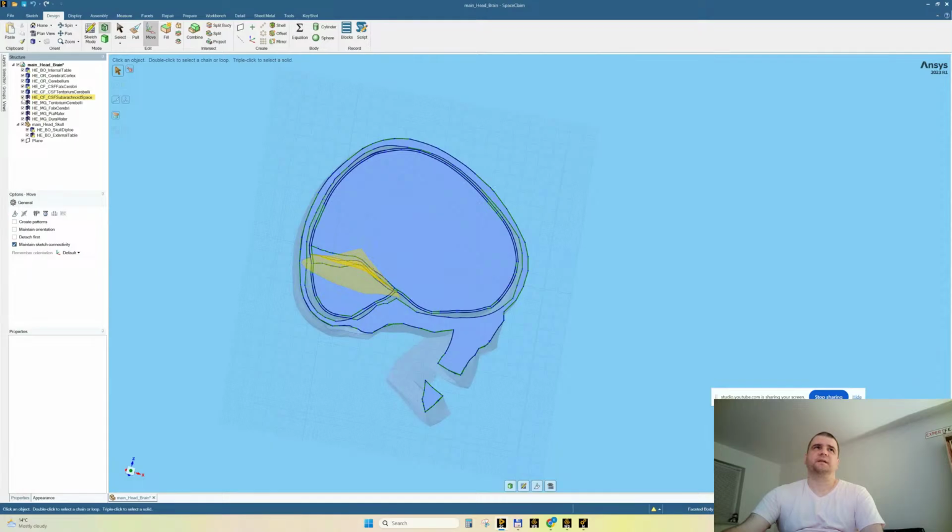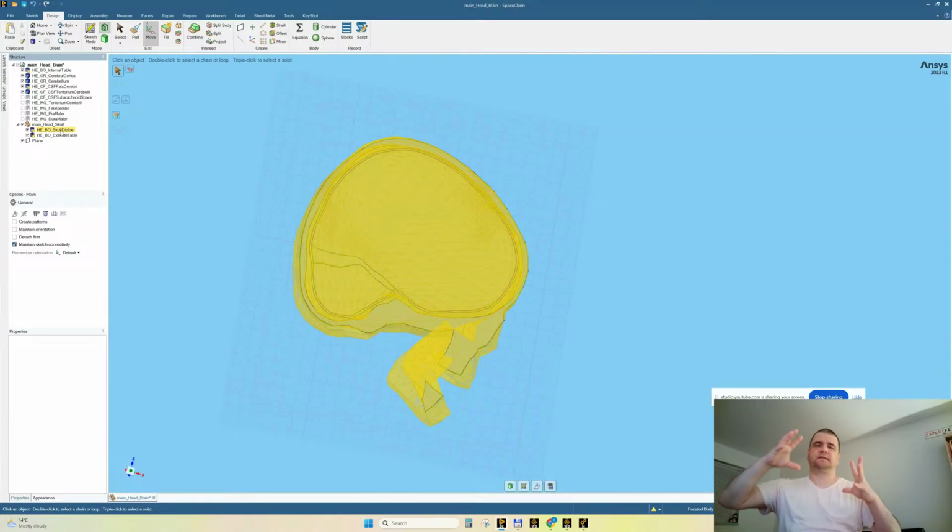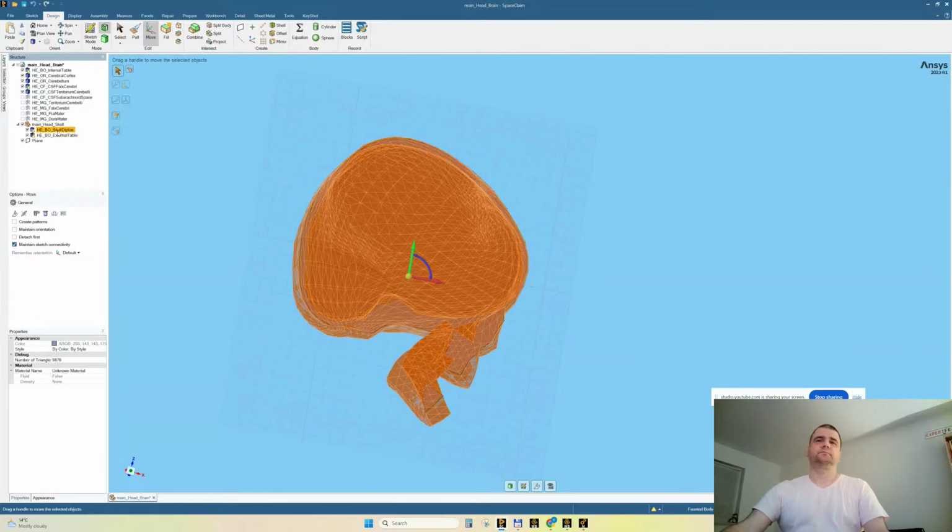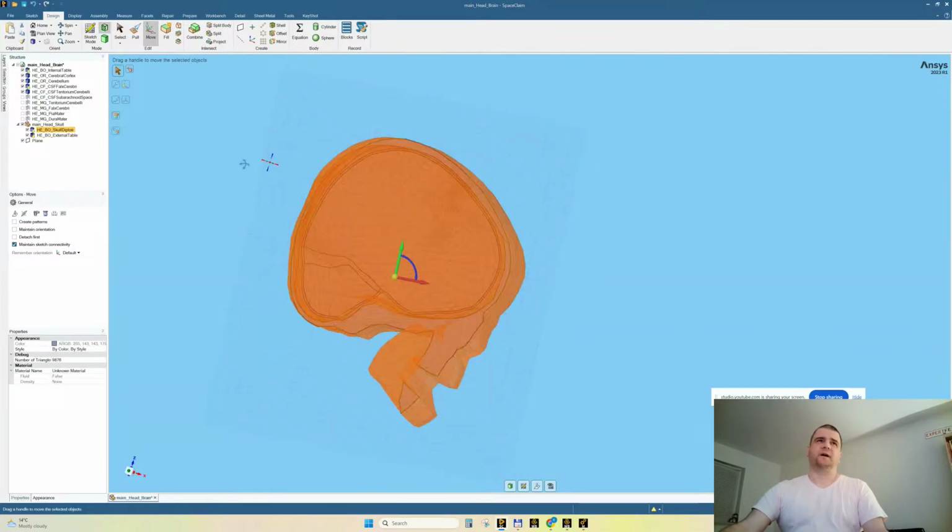So for example, let's hide everything that is surface and keep only, for example, the solid part of the skull. Let's say the skull is a solid body, even though this is an STL that is not solid. But this can be easily exported or solidified, let's say. And this is a surface.